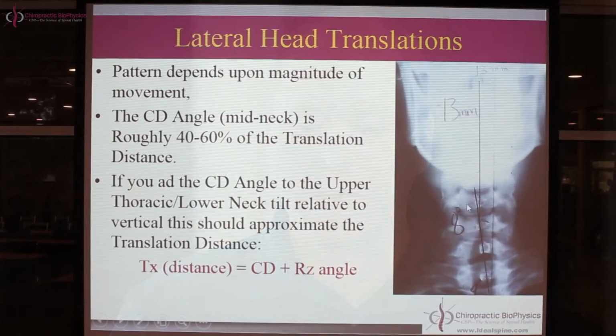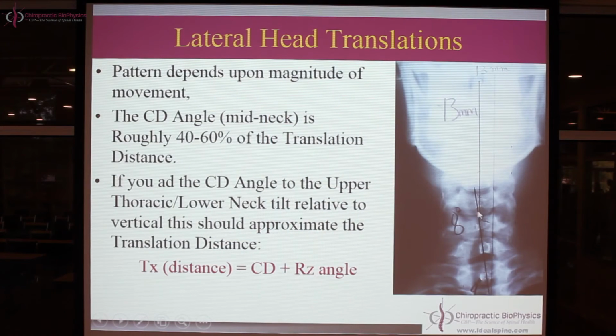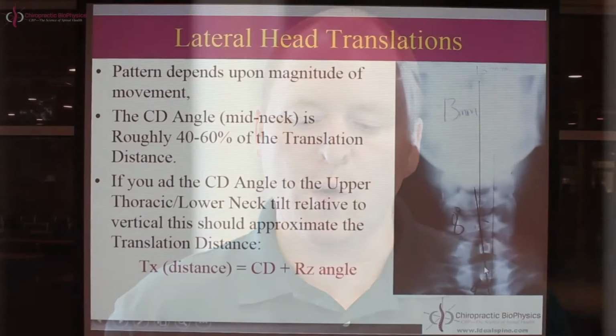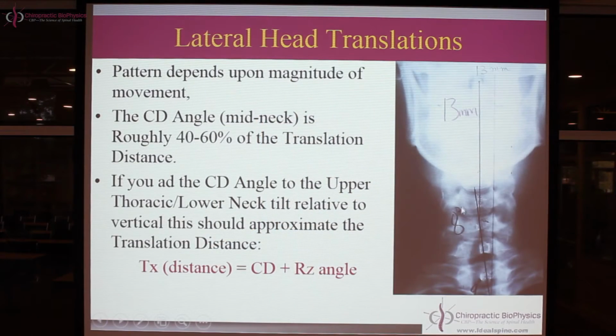We're interested in the mid-neck angle. So my angle right here that's created by my opposing bending angles, this mid-neck angle says it's 8 degrees. I'm also then interested in the low neck tilt angle. This one says 9 degrees. So I have a low neck tilt to vertical and a mid-neck tilt angle, and those two angles are created by this horizontal offset, or the tilting angles create the horizontal offset itself. Okay, either way, this is driven by a head posture of left and right translation.